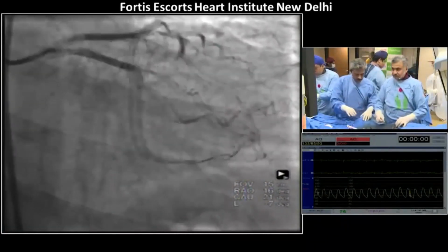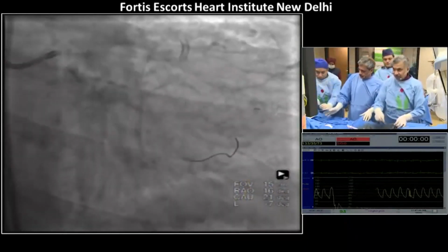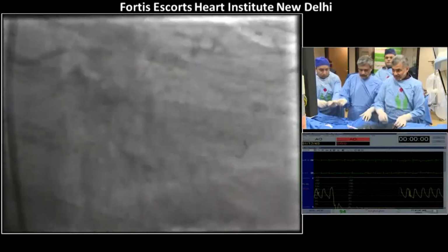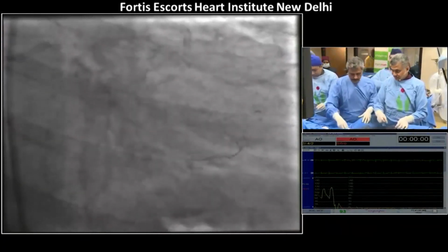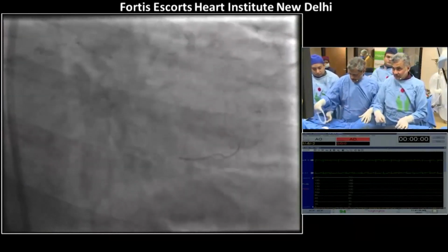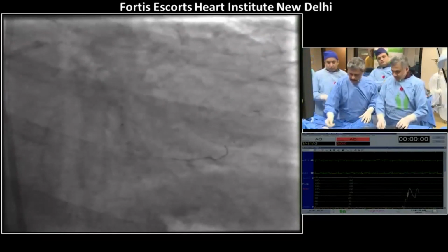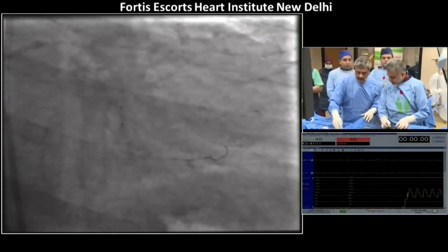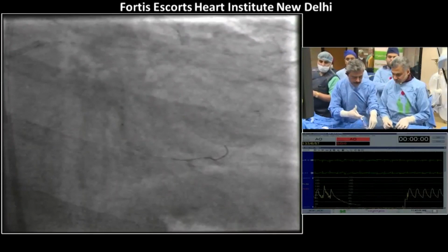All right, go. I hope it doesn't slip. No, it won't slip. I have full confidence. Okay, let us see. Can we check? Yeah, all right, let's do it. I'll fill up the syringe and ready.